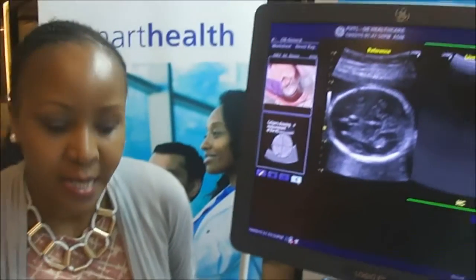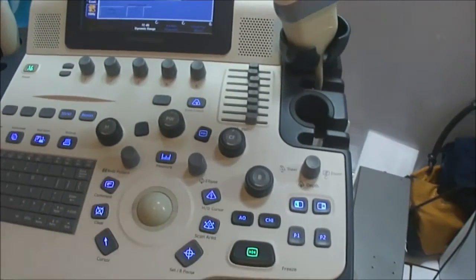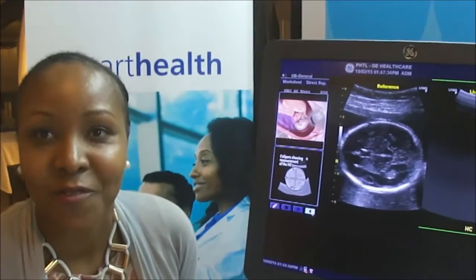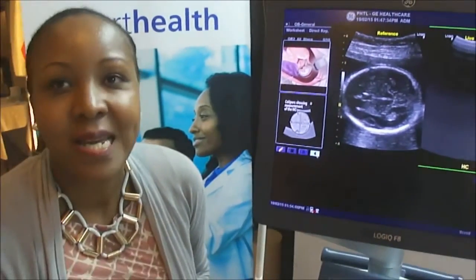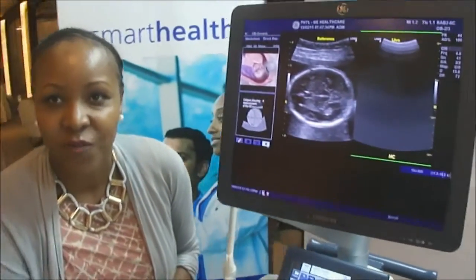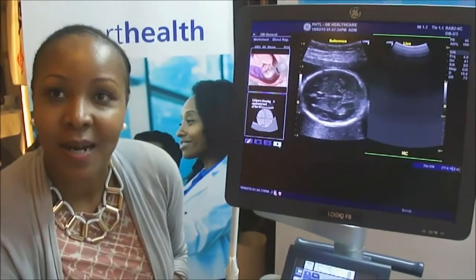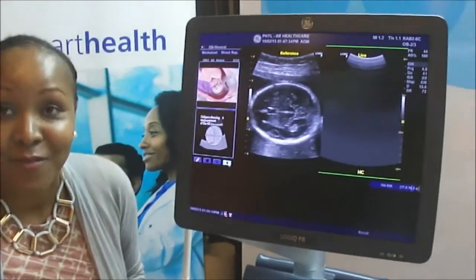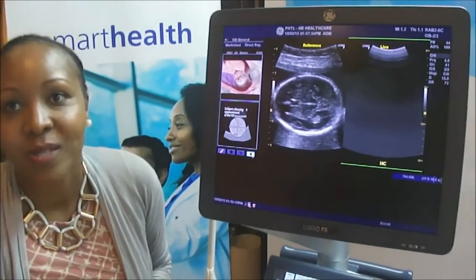You have harmonics, which makes the image really clear. And a very nice feature is the auto-optimization, which helps the sonographer. As you're scanning, it automatically does it for you — you're not going there trying to figure out what keys to change, or the time gain compensation for example. You just start scanning, hit auto-optimization, and the machine does it for you like magic. So you really cut your scan time.